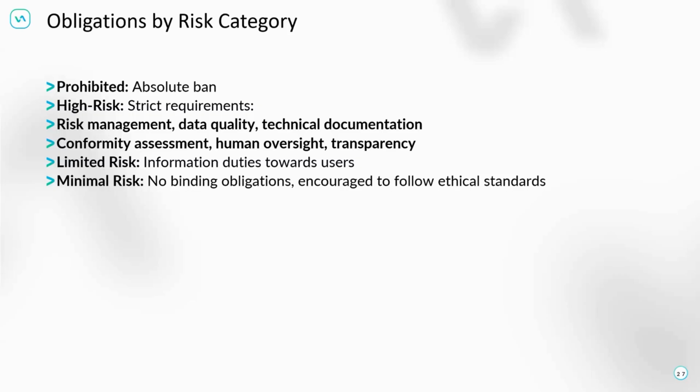The data quality needs to be very covered, and that is validation of the medical device. So if you have the medical device, you can have the data quality compared directly with the validation of the device. Technical documentation extends a bit compared to the medical device, what we already had, and it still contains a conformity assessment as described. Human oversight and transparency requirements need to be managed and need to be created and shown. However, the oversight can be, and that's a good thing on medical devices, the human oversight can be totally covered in the post-market surveillance system we already have for medical devices at all.